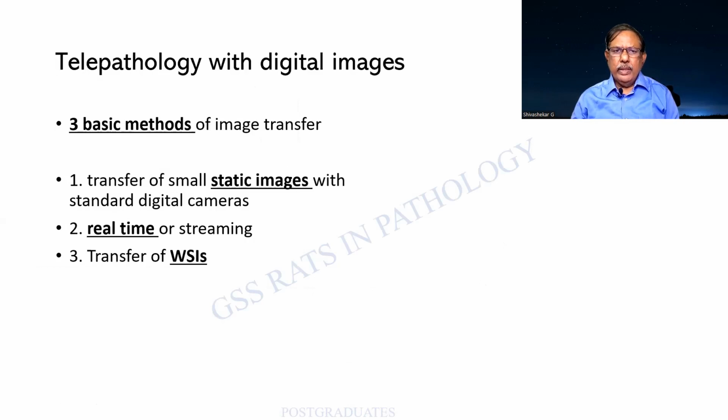Please do remember, this is a very important slide. There are basically three methods of digital imaging. One is called static images. Two is real time or streaming. Third one is whole slide imaging. There are three basic methods. This I would like you people to kindly remember.